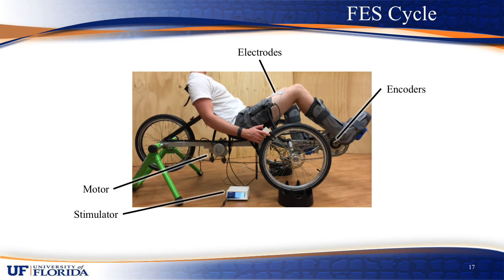In the preliminary experiment, the delay was estimated by first using a constant estimate of the delay and measuring the delay before and after 2 minutes of cycling. The rate of change of the delay was then calculated. Then this rate of change was used to implement a time-varying estimate of the delay.